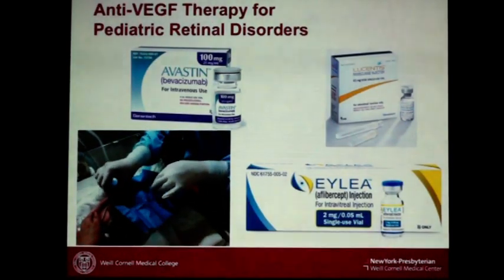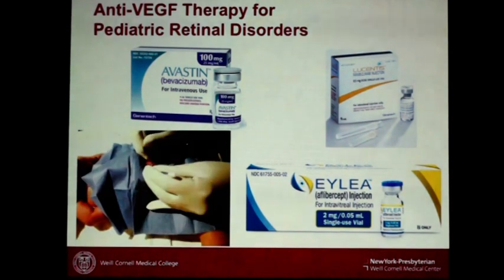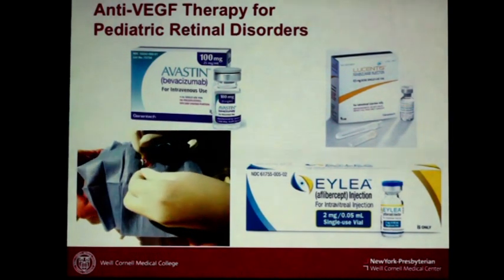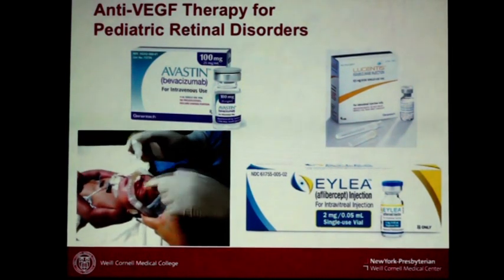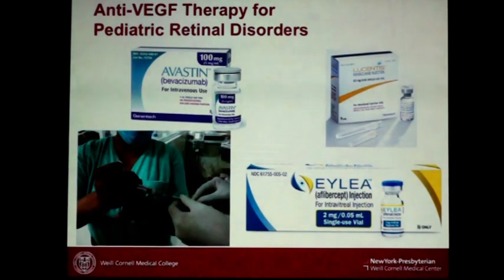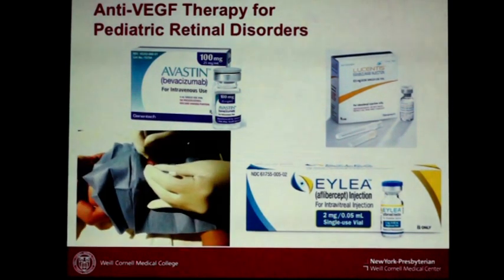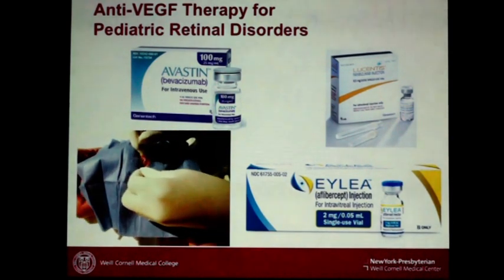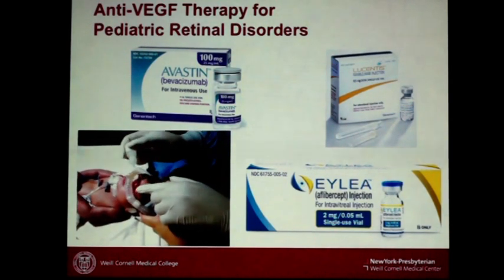Why is this going to become more important for us? Because in children now, I think there's more and more popularity of injecting anti-VEGF treatment. We already know that there are vascular changes that occur in children who are injected with Avastin for ROP. So we're going to have thousands of children walking around post-injection, and we're going to need to get fluoresceins, because we have to document these changes appropriately. And we don't know how long that's going to be. Maybe 3 years, 4 years, 5 years. But monitoring these changes with the fluorescein is very important.